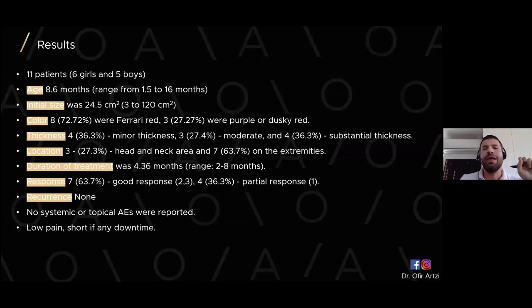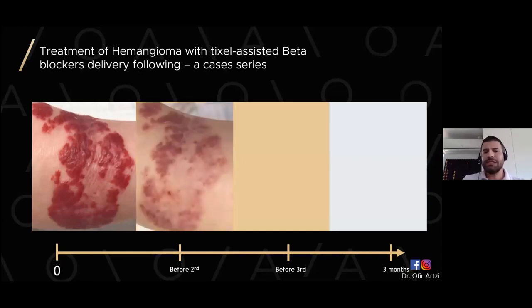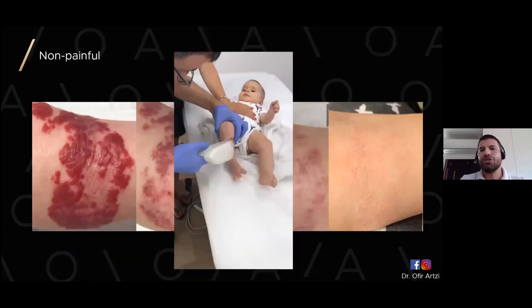4.36 months on average. And we think that generally speaking, the modality in this treatment still has to be maximized, but we are talking about a shorter treatment as compared to just topical application. This is the before, this is before the second treatment, before the third treatment, and this is 3 months post last treatment.